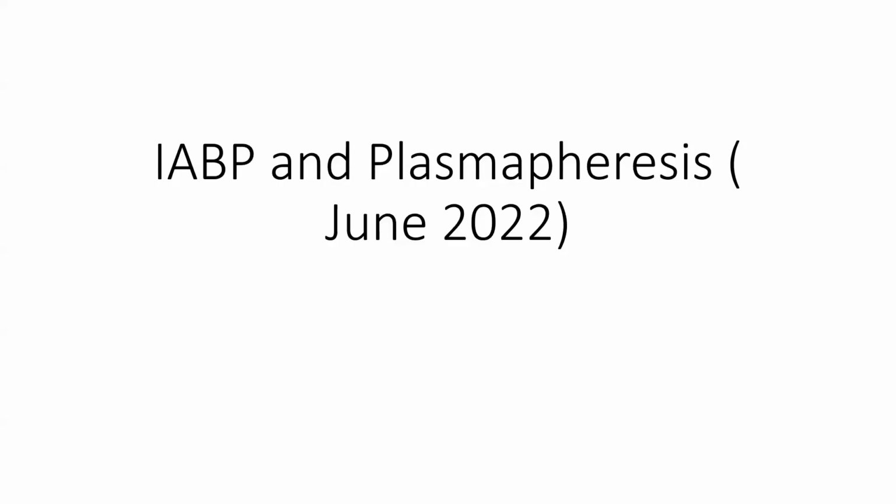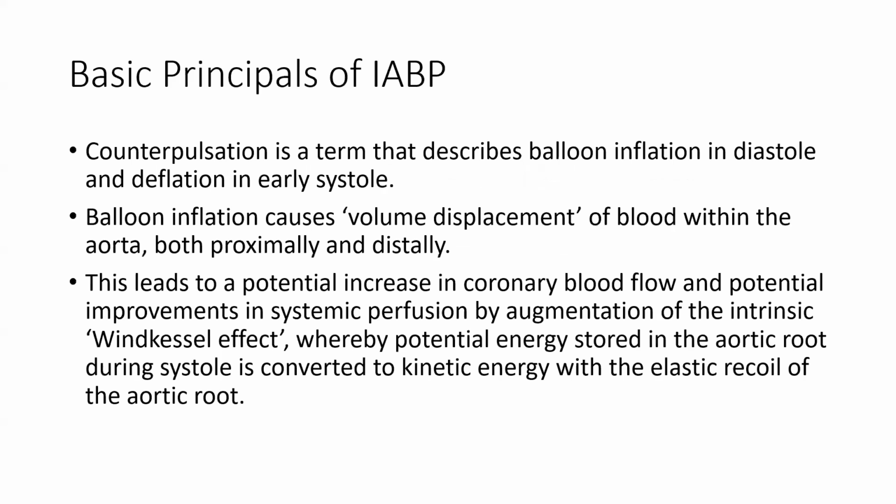Hello friends, today we are going to discuss this question which was asked in the DrNB Critical Care Exam, June 2022. The question was regarding the intra-aortic balloon pulsation. So we'll see what is the basic principle of IABP.